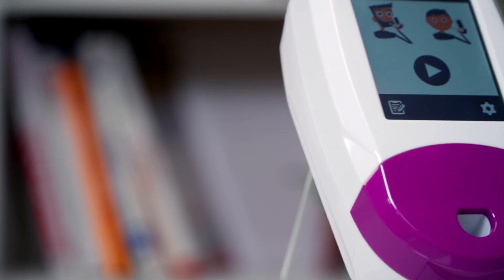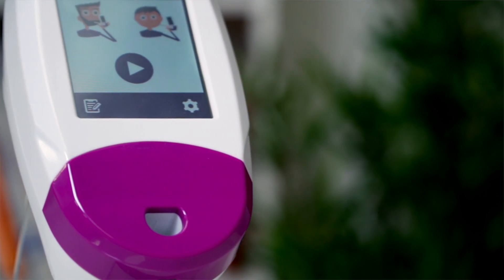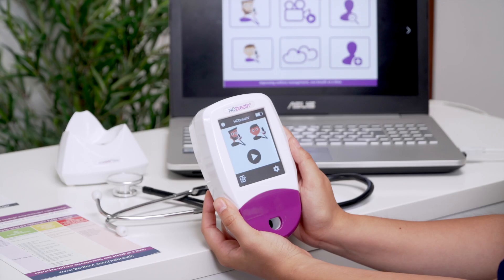Each device will automatically be preset to the PIN code 0000. It is highly recommended that you change this PIN to a four-digit number that you will remember.